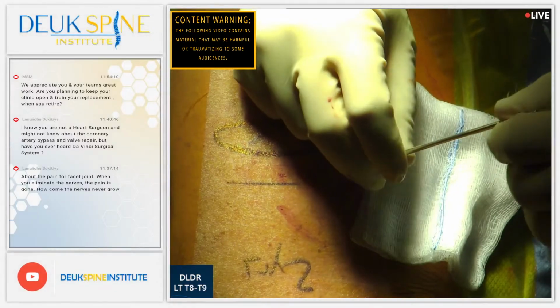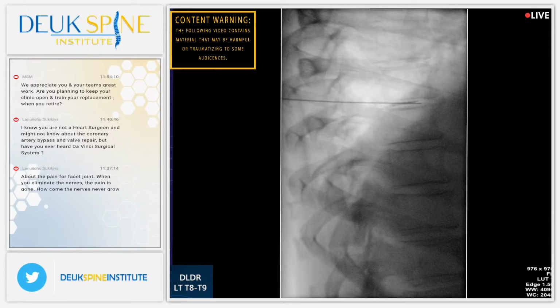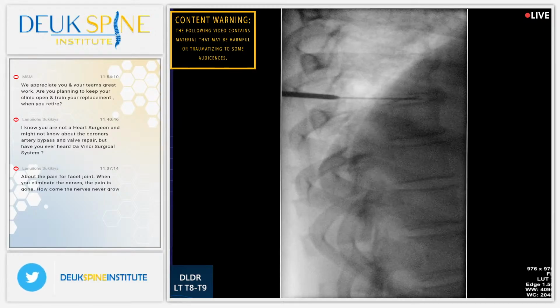We were able to finally get into the disc. There was a small path. Now he wants to wake up. Lay still, you're doing great.